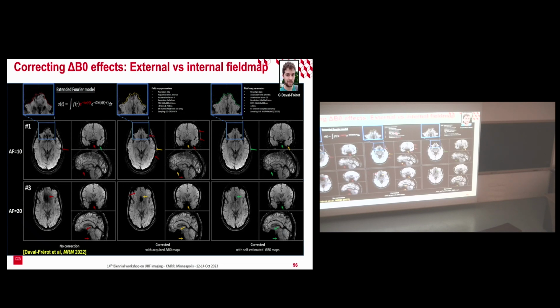Okay, nice. And if you do that, in comparison with the uncorrected reconstruction, represented here, you can collect additional information through an additional scan, an additional sequence. So this is time-consuming and so on. But you can do that, for instance, at a resolution of 2 mm instead of the native acquisition of 0.6 mm isotropic, with multiple echo times to have a nice estimate of the delta B0. Then you end up with very decent images in comparison with that.